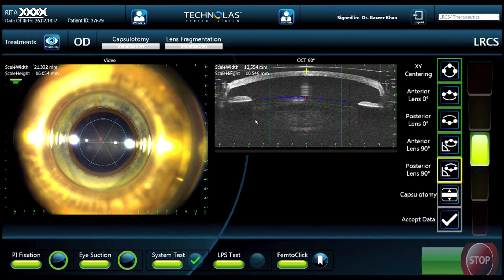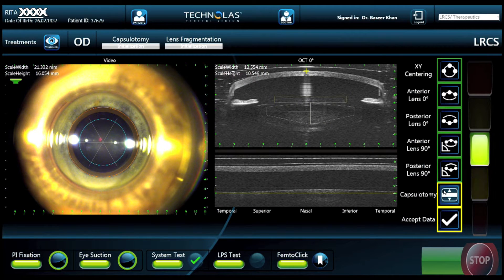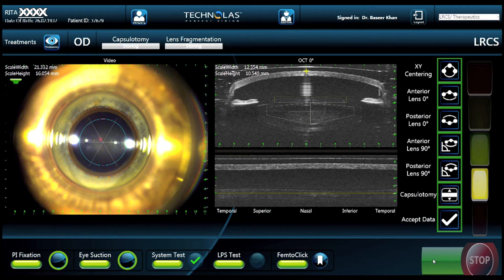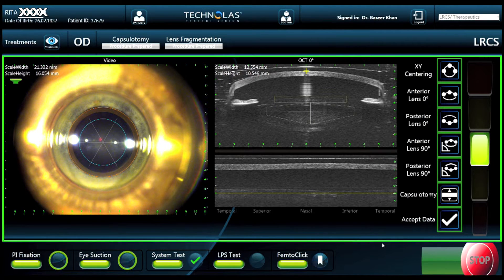There is a one-millimeter safety zone between the posterior limitation of energy delivery and the posterior capsule. When we activate the capsulotomy, we can see the column of energy that will be applied to the anterior capsule. We want to make sure the anterior surface is within the vertical height of that column, 360 degrees. The next step is to ensure our applanation pressure is adequate, indicated by the yellow bar on the right-hand side. Once done, we click start and the green box comes up indicating it's okay to begin therapy.